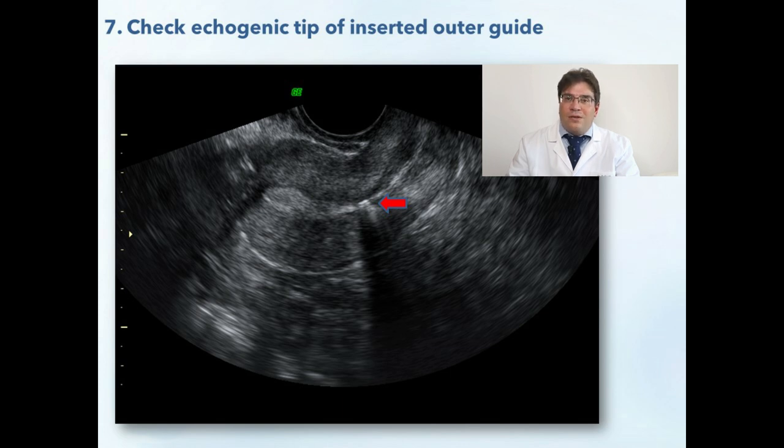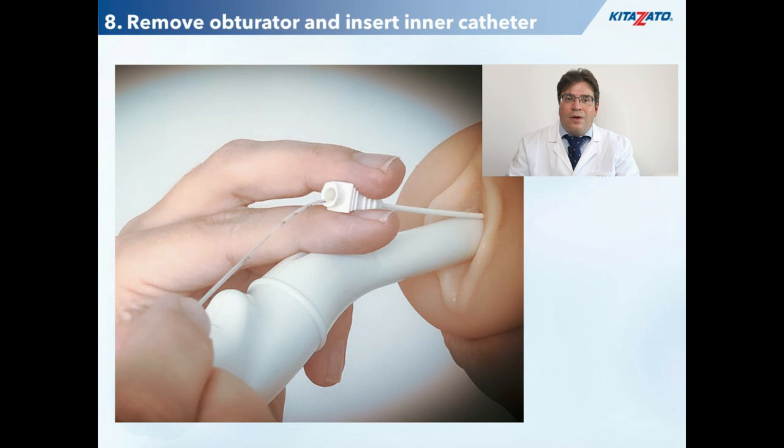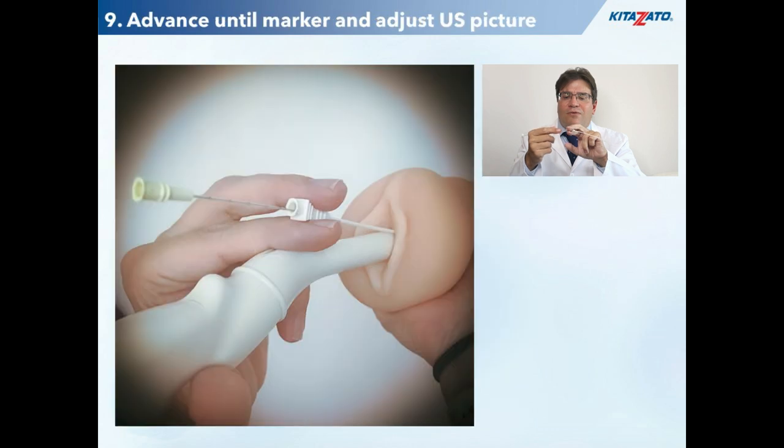When you have confirmed this, you could signal your embryologist to start loading the embryo into the inner catheter. When the embryologist has arrived to your side, the soft obturator of the outer guide is removed and you could start introducing the distal part of the inner catheter. Because it is made of a very thin silicone material, you should always hold it in axis and advance it very gently and slowly. You could hold the inner catheter at its more rigid proximal part. When you have almost introduced the inner catheter, you should advance it until the double line marking at 4 cm.